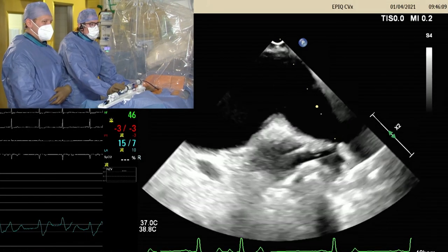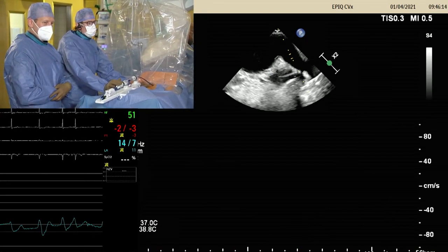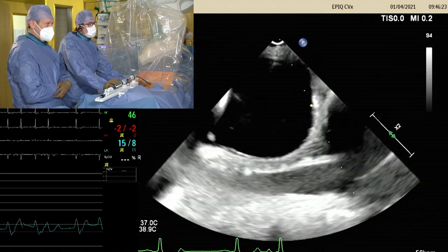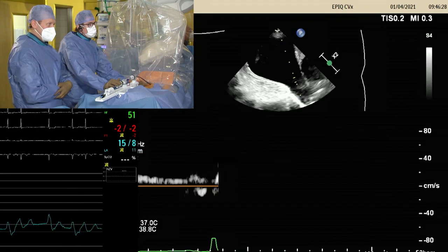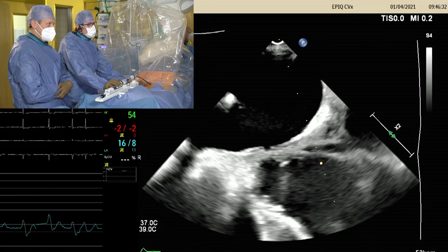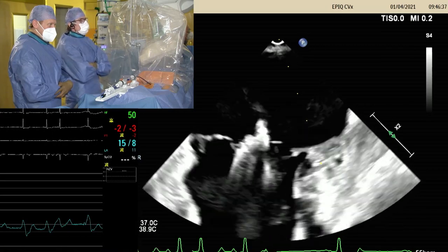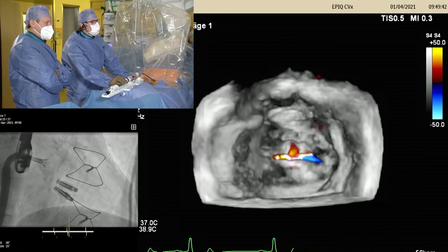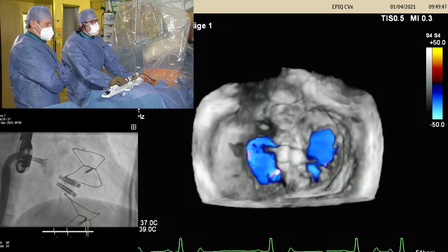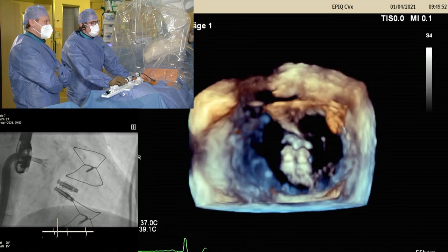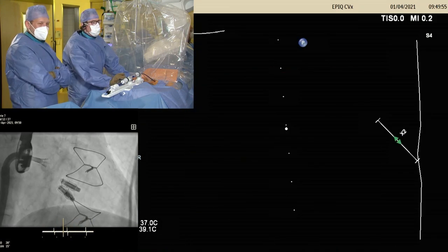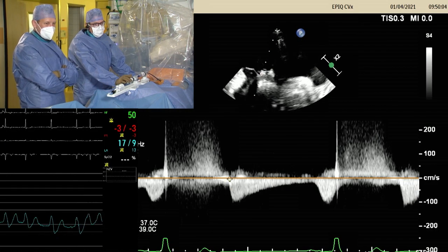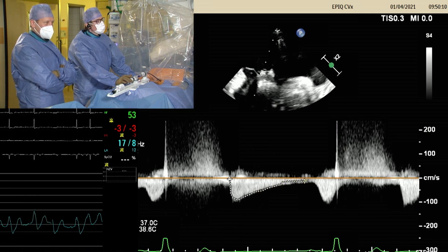Left atrial pressure tracings now show no relevant remaining V-wave and generally low left atrial pressures. Mean LA pressures have been brought down, which is highly predictive for outcome. Normalized pulmonary venous inflow is observed. With a systemic blood pressure of 170/70 mmHg, the result is less than trace mitral regurgitation — an excellent result.